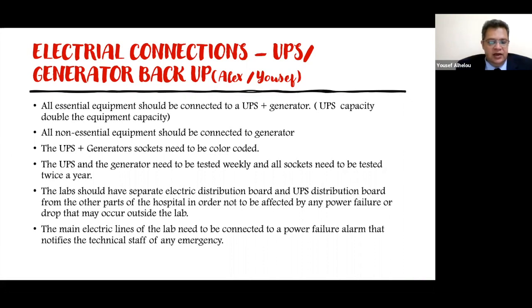And the other point is we need to have a power failure alarm on the main lines of the UPS and generator, just in case there is a power failure in the evening when there is nobody in the lab and the generator or the UPS do not work. We can get an alarm and take action.